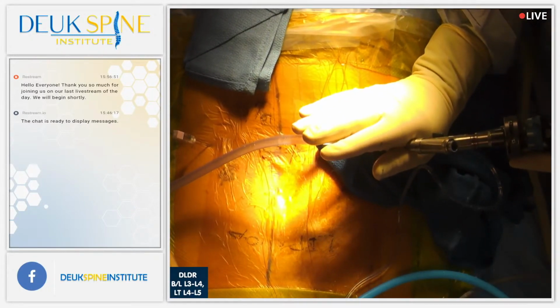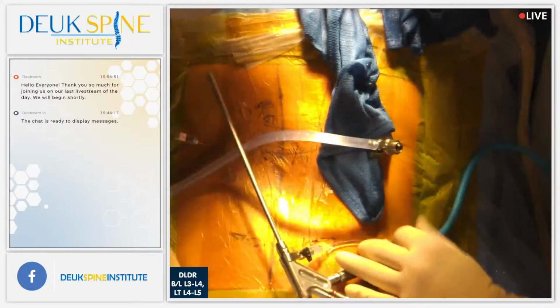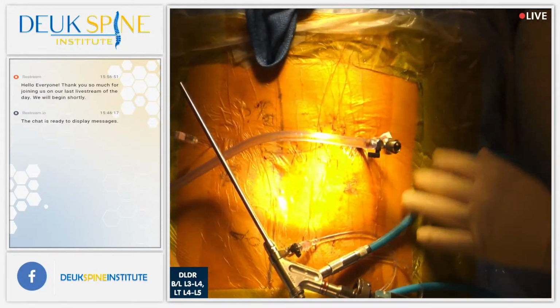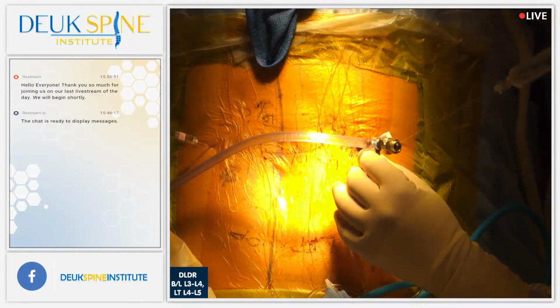Henry, have we shown the video on how the discs cause pain? Yes, but not how the Deuk laser disc repair works. We did that one or not? We did not. Well, why don't we do that while we're irrigating? Of course.